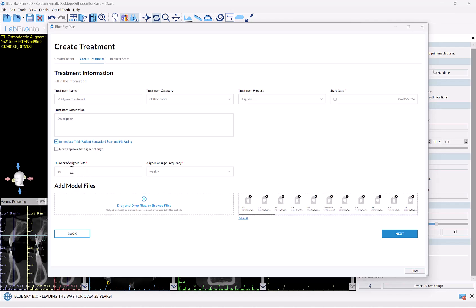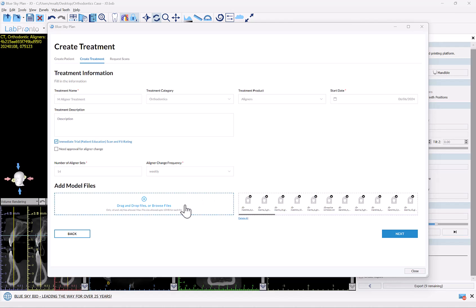We have the number of aligner sets, which is pre-populated based on the Blue Sky Plan information, and we have the aligner change frequency, which again is pre-populated. At the bottom we have the relevant data files. Since we've transferred the data directly from Blue Sky Plan, there's nothing that has to be done at this point — just click Next.